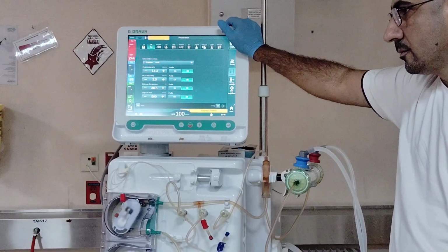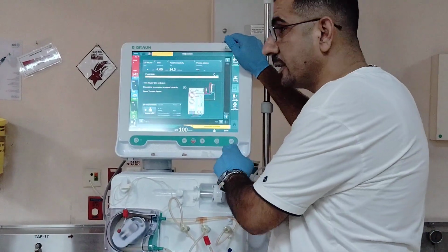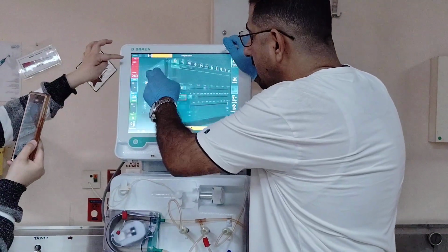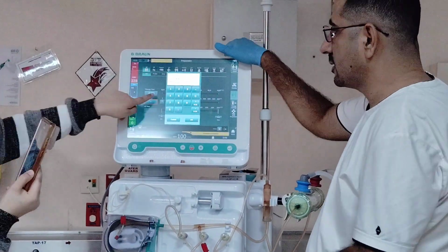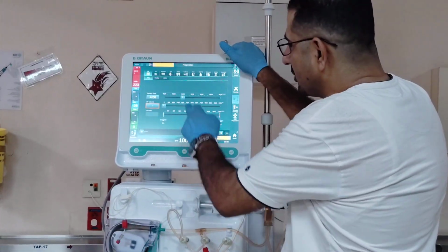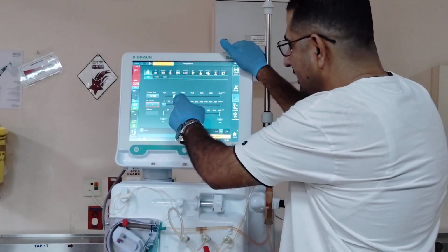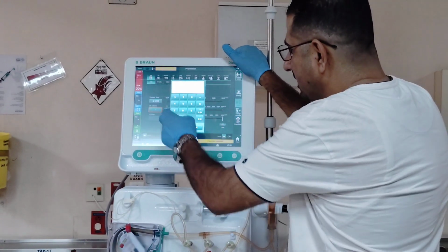And for the dialysis time, the minimum is 3 hours only. Sorry? The time for dialysis. Yeah, as soon as you press here, you can change the therapy time. Yes, you can change it. You can either use that one or manually, or by this one.